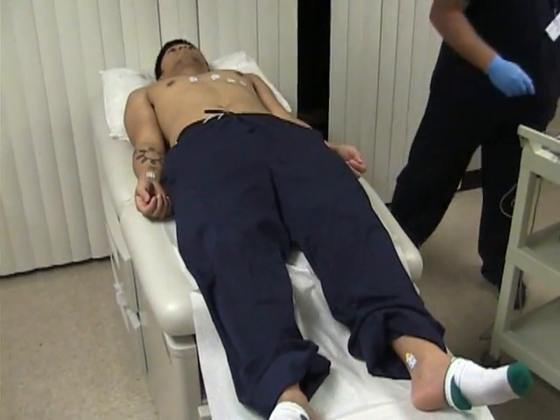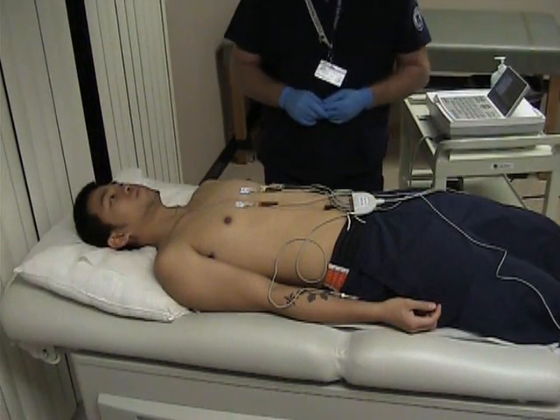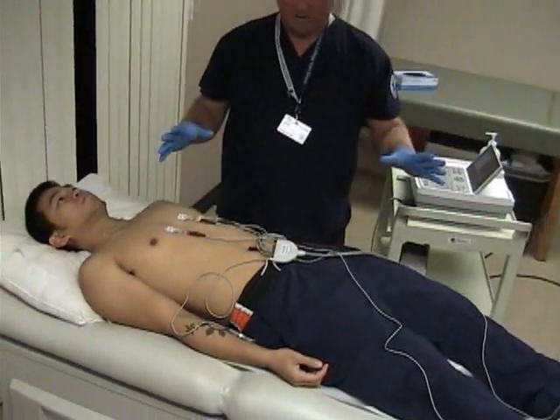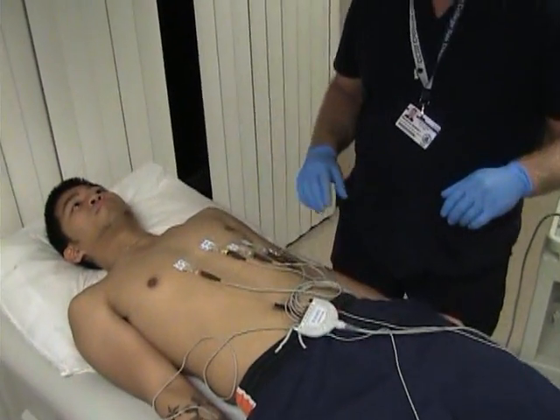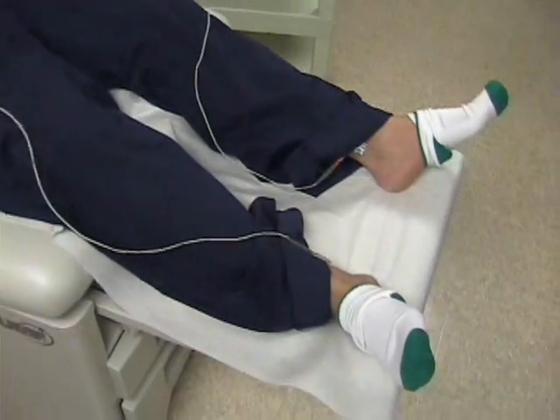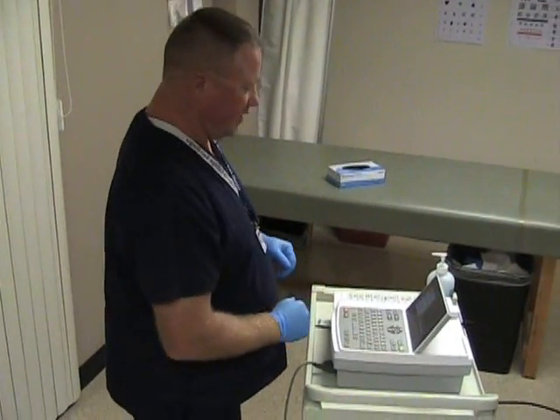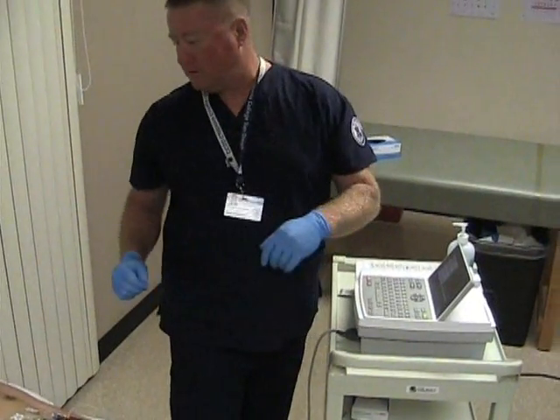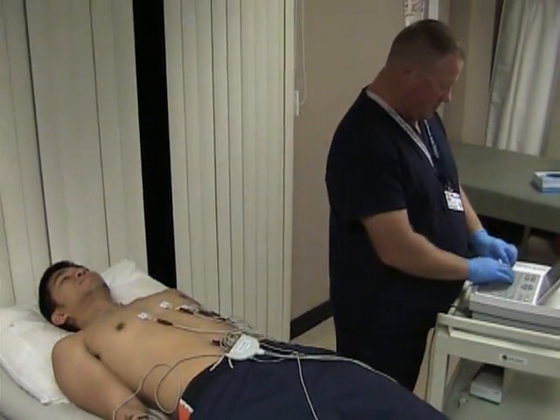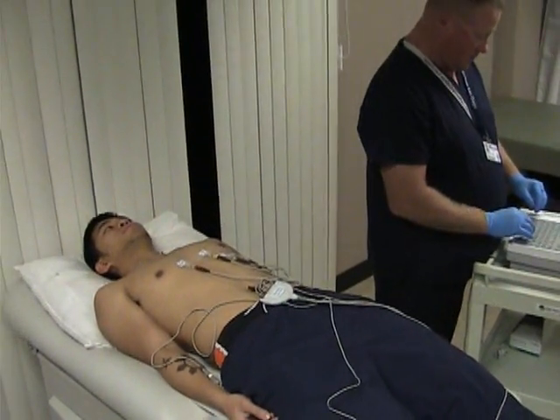Now our leads are in place. We'll connect all the limb leads with the limb leads and the precordial leads with the precordial leads. I'm going to ask my patient a few questions such as his name and date of birth and enter it into the EKG machine. So Mr. Ruries, your first name? Arthur. And your date of birth? September 5, 1992.